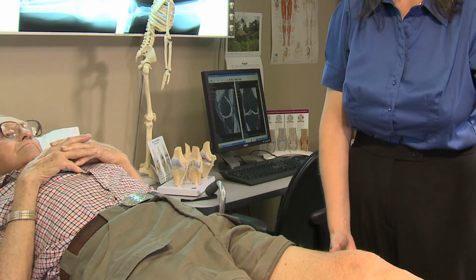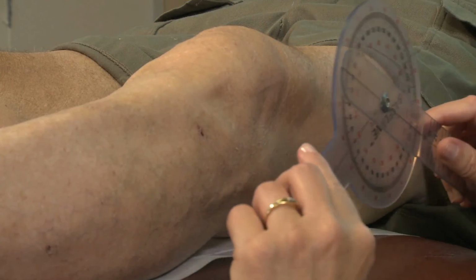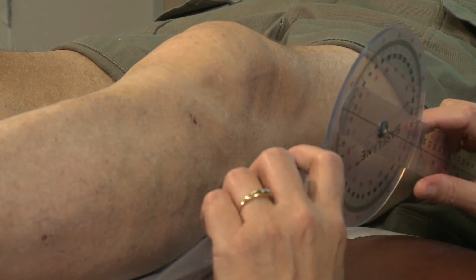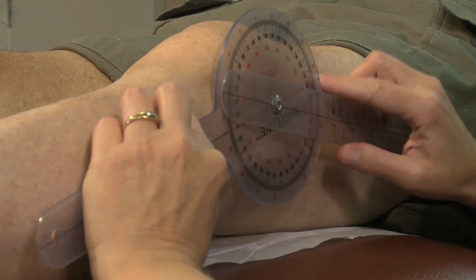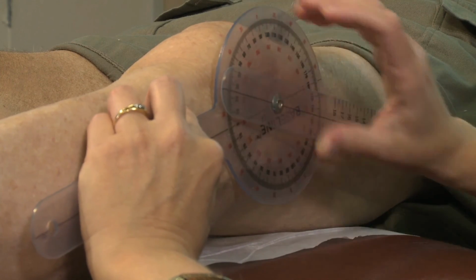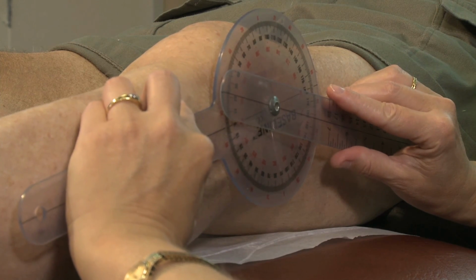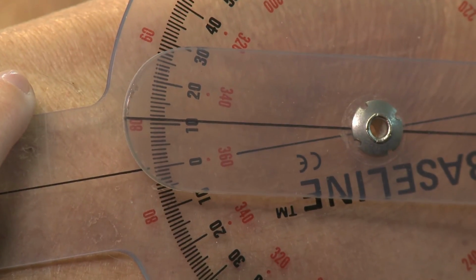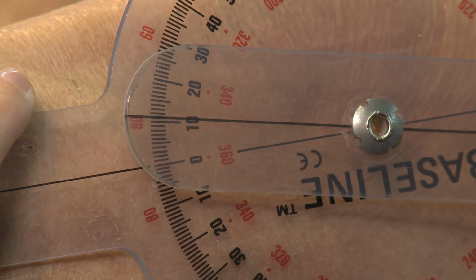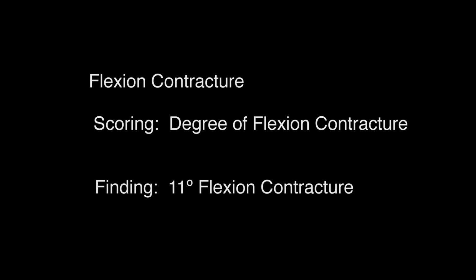Flexion contracture. The subject is supine. The examiner asks the subject to extend the knee as far as possible. The examiner centers the goniometer at mid-patellar level laterally over the knee and aligns one arm of the goniometer with the greater trochanter and the other arm with the lateral malleolus. The examiner then reads off the degree of flexion contracture. Flexion contracture is scored as the number of degrees of flexion contracture.